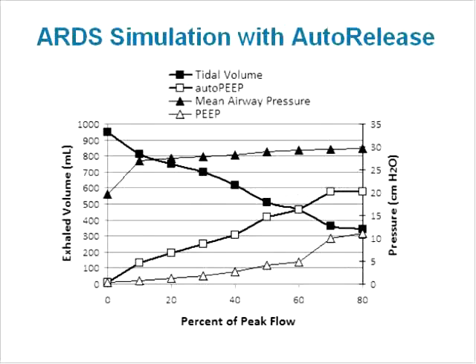The change in expiratory time was a small fraction of the total cycle time, so the increase in mean airway pressure was minimal. PEEP at the airway opening increased above 0 as expiratory time decreased and ranged from 20 to 50% of auto-PEEP for peak expiratory flow percent greater than 0. This inadvertent PEEP was caused by the resistance of the expiratory limb of the ventilator circuit, not to be confused with the auto-PEEP. What we can conclude from this study is that appropriate use of the APRV mode requires careful consideration of the complex interactions of ventilator parameters.